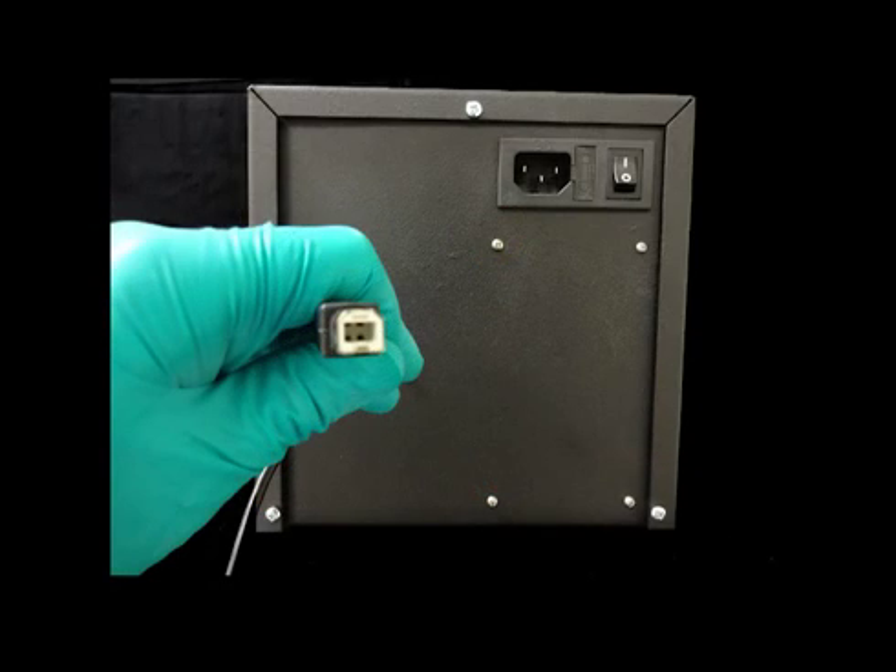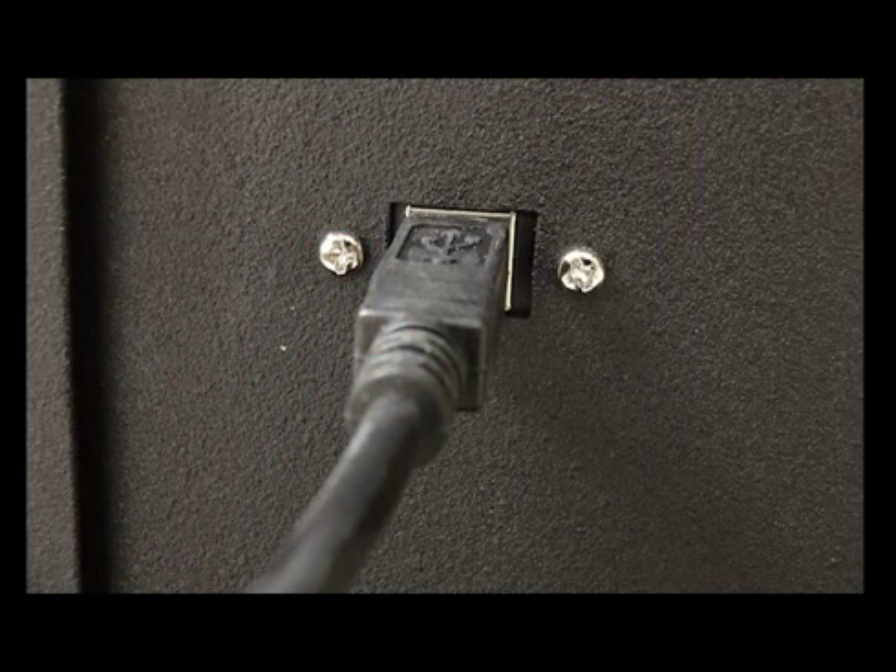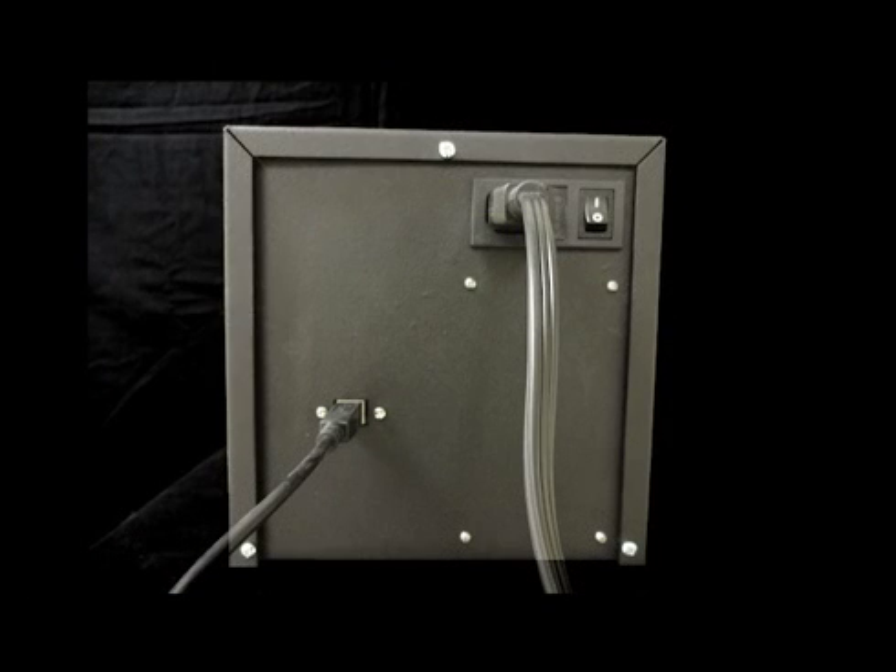Now, connect the USB cable included with the Ossiflow to the rear of the Ossiflow. The opposite end will connect to your computer.